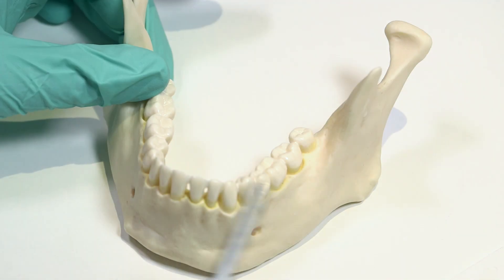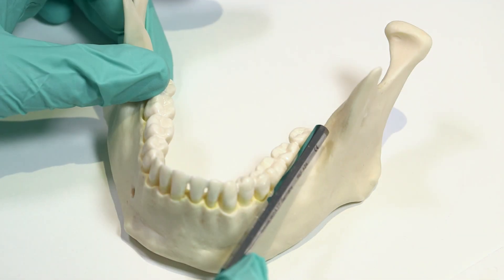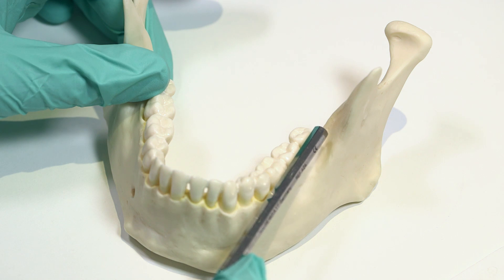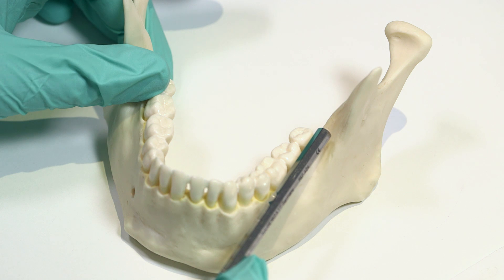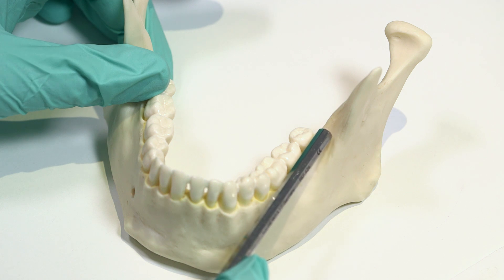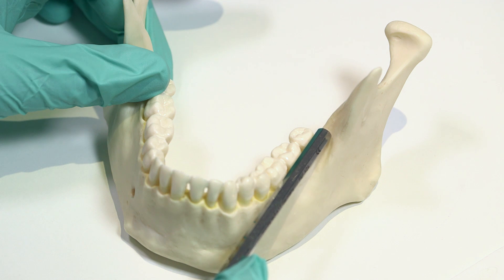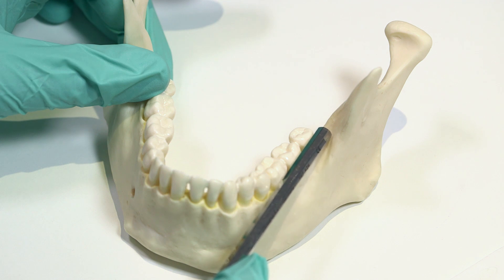The target bony site is the anterior border of the ramus, targeting the nerve as it leaves the pterygomandibular space crossing the ramus of the mandible before it pierces the buccinator. The soft tissue landmark is the mucous membrane distal and buccal to the last molar in the arch.